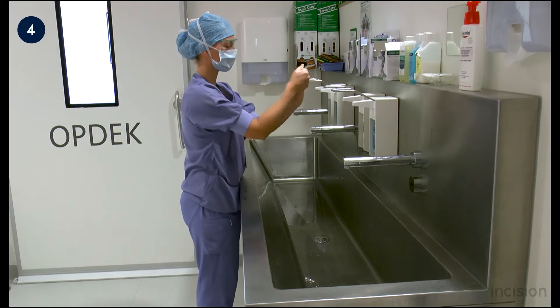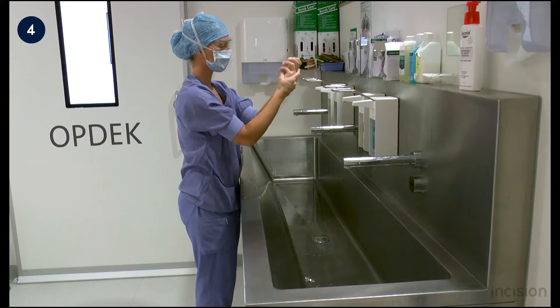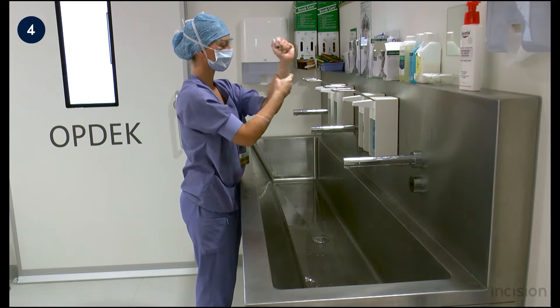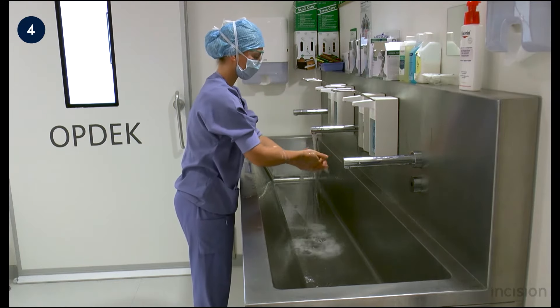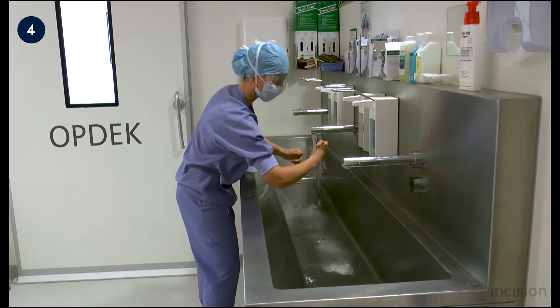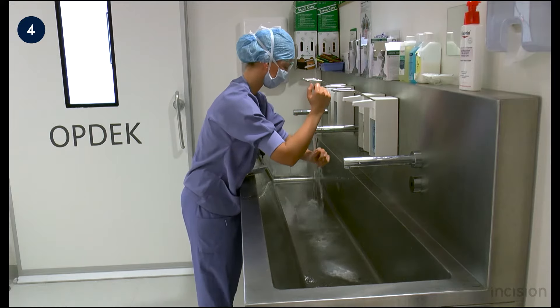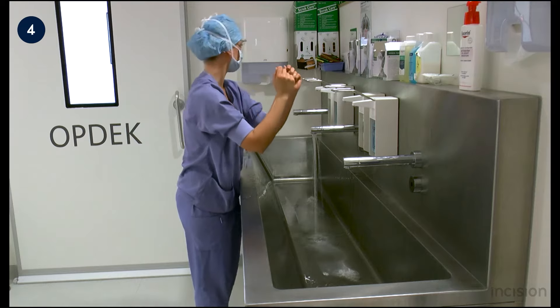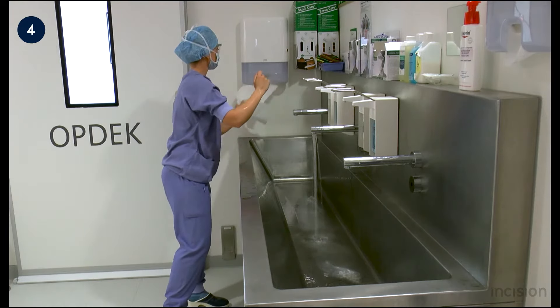The hands are scrubbed for two minutes with soap. Do not forget to scrub the wrists extensively. Rinse the hands and forearms with water, keeping the hands high so the water goes from distal to proximal to ensure that the water from the unwashed arms does not contaminate the clean hands. Afterwards, the hands and forearms are dried with disposable towels.